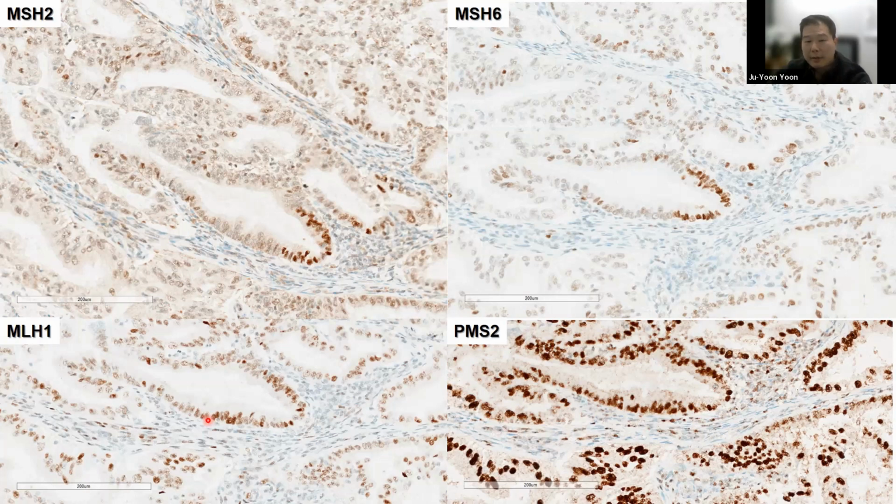Certainly, if you go back to some of the papers that I showed you earlier, you can see this subclonal pattern in cases with MLH1 promoter methylation. But as a surgical pathologist, this is one of the cases that I'd be a little more careful with. You could even make the argument that you could potentially defer full interpretation of MMR proteins until you have the molecular correlates, but it is highly suggestive of a subclonal pattern.